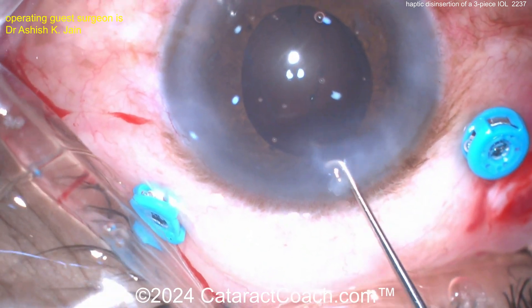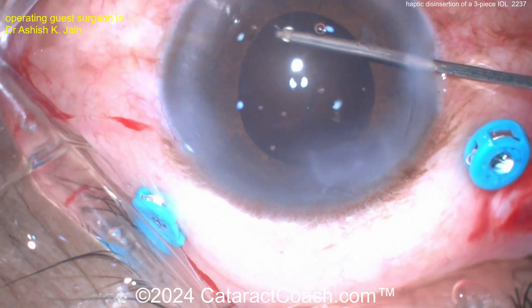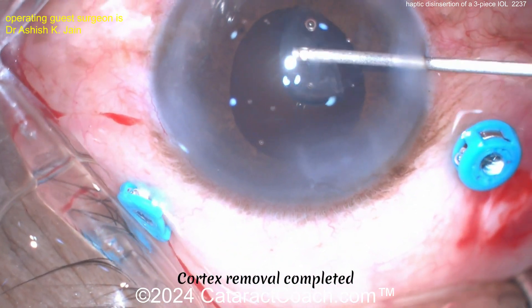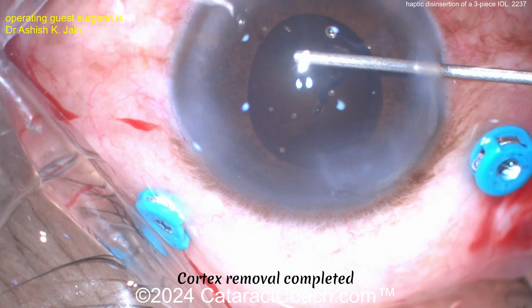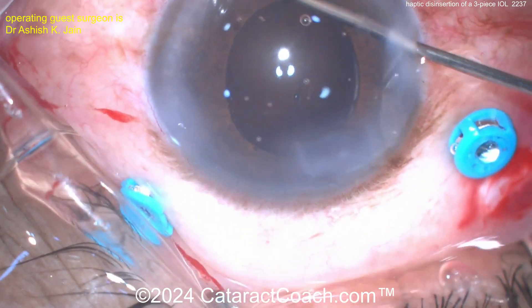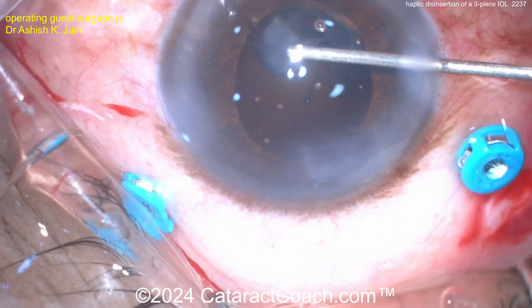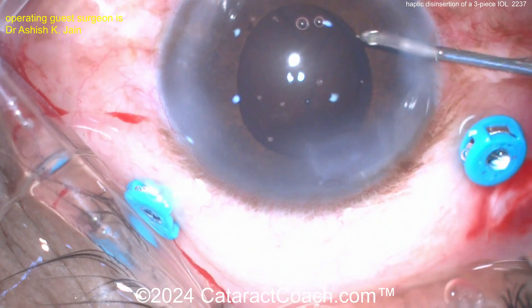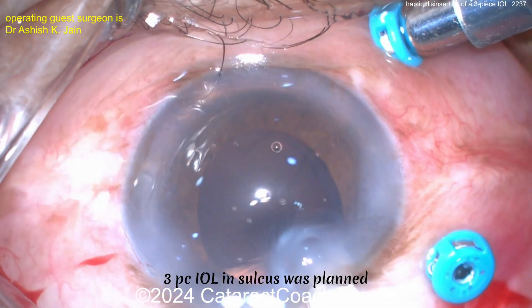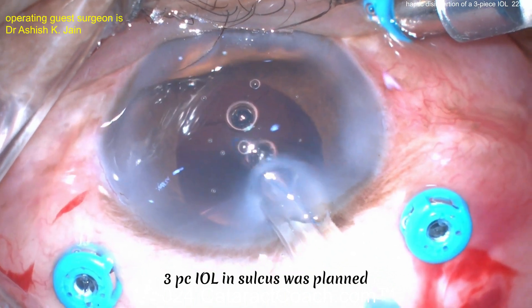Get that out of the eye — you want to make sure there's no retained lens material left. The surgeon is cleaning up a little bit more cortex. Again, using the vitrector is very easy; you can either leave it in vitrectomy mode, which is I/A cut mode, to remove the cortex — just don't engage the cutter with your foot — or if you're afraid you will, just use cortex mode. Now here comes the three-piece lens planned for sulcus placement.